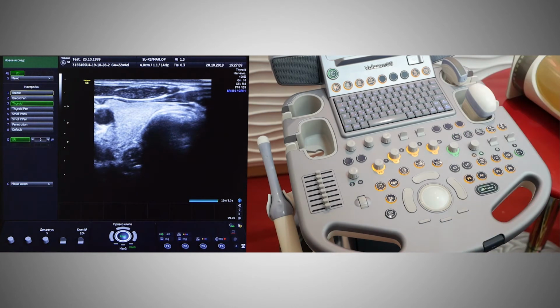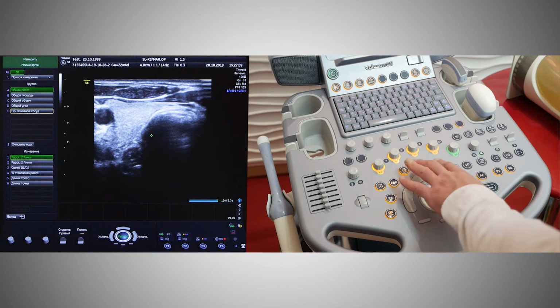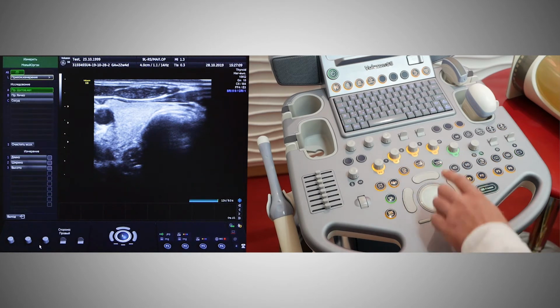Taking measurements on the Voluson S8. There are simple measurements and complex measurements. Simple measurements involve the determination of a simple distance, area, volume and angle. It's what we can see in the left column on the screen. When performing complex measurements, we can determine the volume of the thyroid gland with an indicator that corresponds to 0.479.